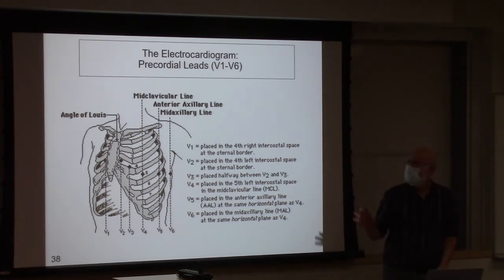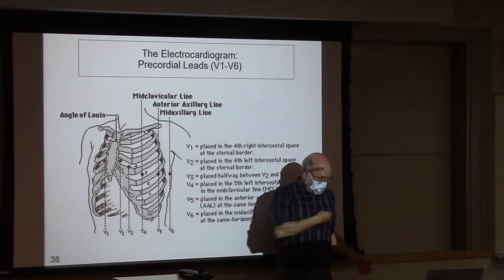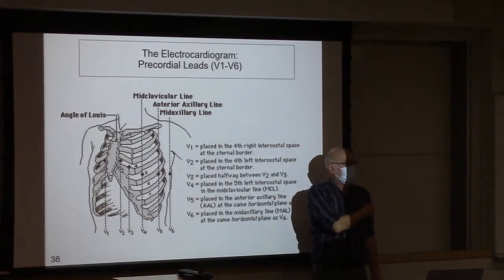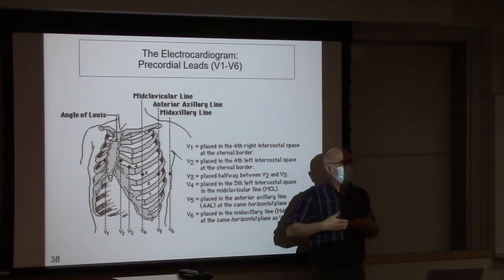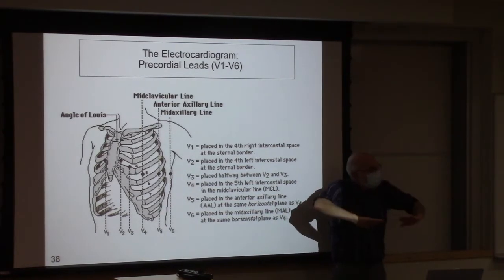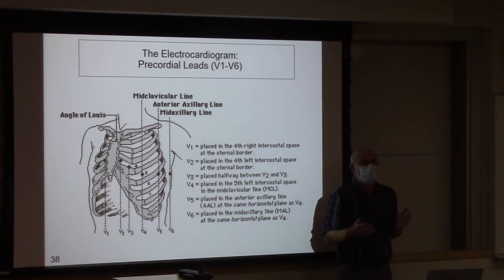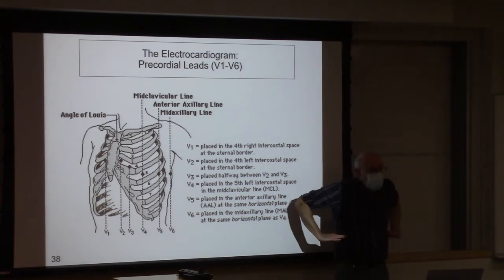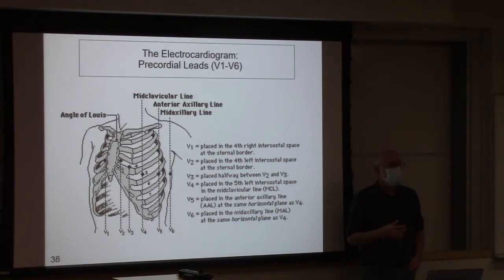So these are the other leads. They record information around the chest. So the limb leads record information that is in this plane, and the precordial leads kind of gather information in this plane. And you can see what we're doing. We're gathering 3-dimensional information. One plane, 2 planes defines a volume, and these leads define those planes.